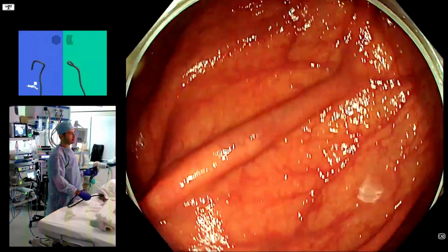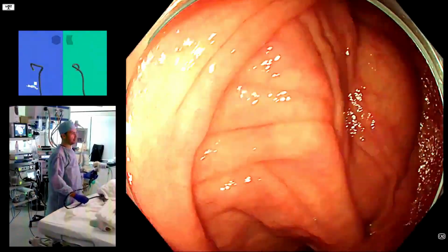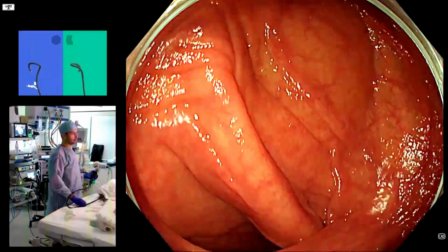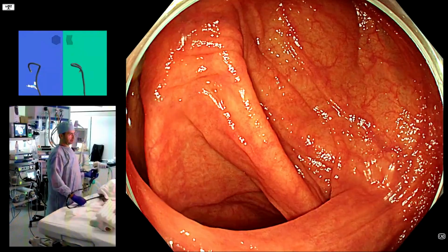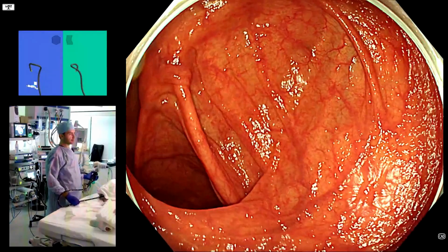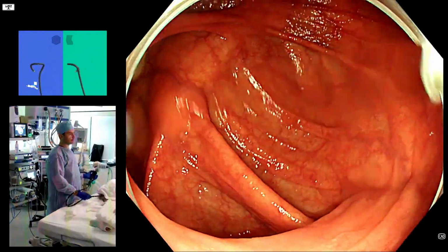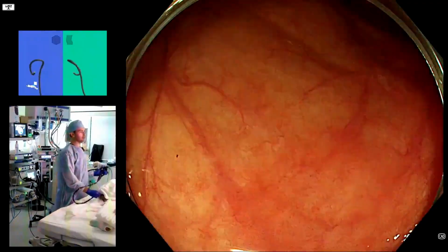So let's again go in, and then let's do some distension. Let's use the cap a bit, and then see if we can see more of what we want to see. So the first thing to do is, because actually the modern generation of artificial intelligence is pretty good at just detecting lesions from afar, right? So we can go into the cecum and just sit.